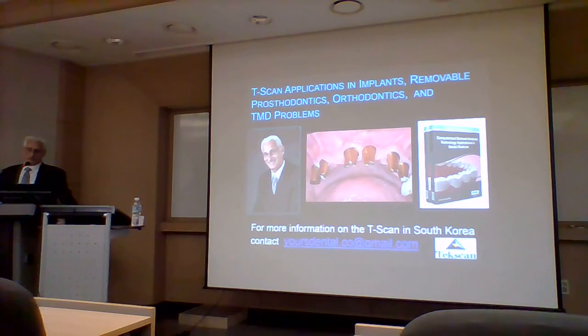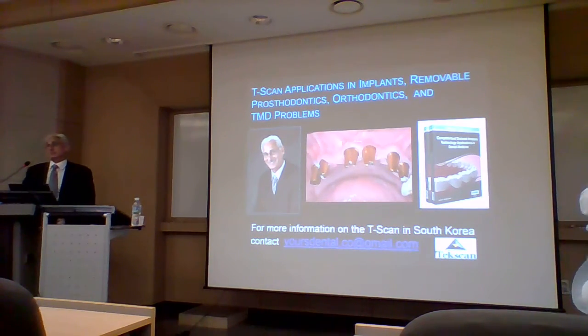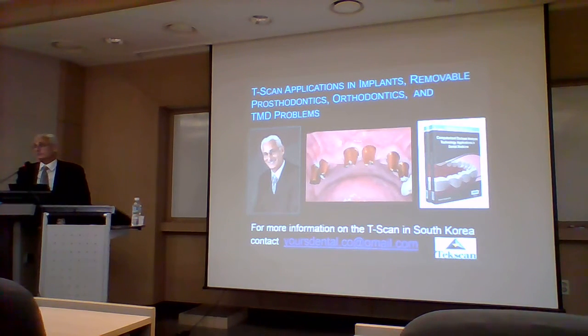So a lot of dentists struggle with occlusion in their practice because they're choosing these marks by eye and they're guessing badly. We actually did a study, I don't know if you probably saw the study or maybe I talked about it. We published a study where we showed dentists six pictures of paper marks, very much like these pictures I would show you, a quadrant, and we had them choose the most forceful contact and the least forceful contact in the picture. And so there were 300 dentists who took the test. They only scored 11% correct. 11% correct. It's like 90% of the time we're going to guess wrong. And that's what it is, it's guessing at ink spots.